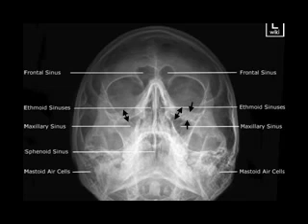Lateral wall of the maxillary antrum. The lateral wall of the maxillary antrum makes a sigmoid curve meeting the alveolar process at an acute angle. If there is erosion of the lateral wall, then this sigmoid curve becomes a straight line. Medial wall of the maxillary antrum.